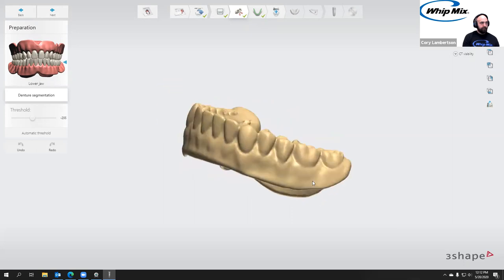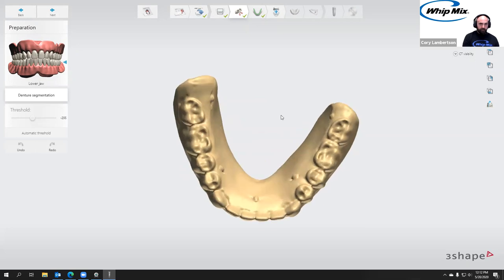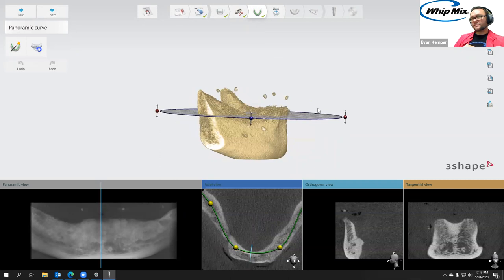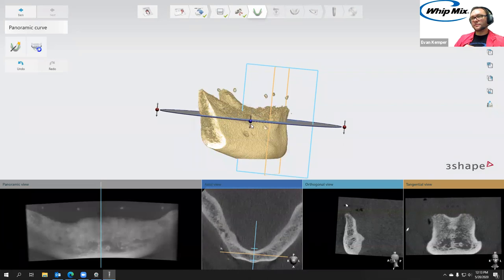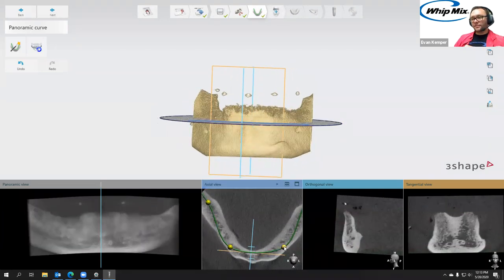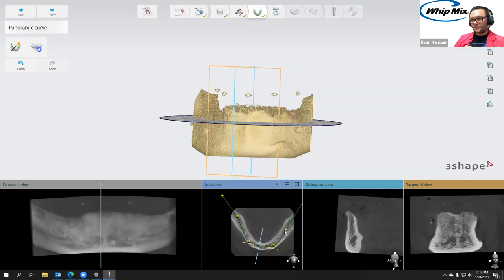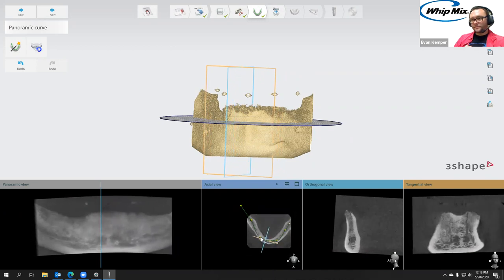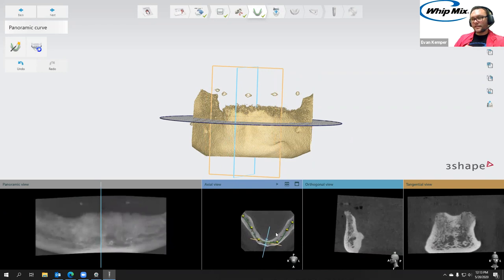There's the denture — looks sharp and crisp. Now we're going to be doing our panoramic curve, same as Monday, except I'm just going to bring it a little further down into the bone. We adjust these yellow points and that makes our panoramic curve.